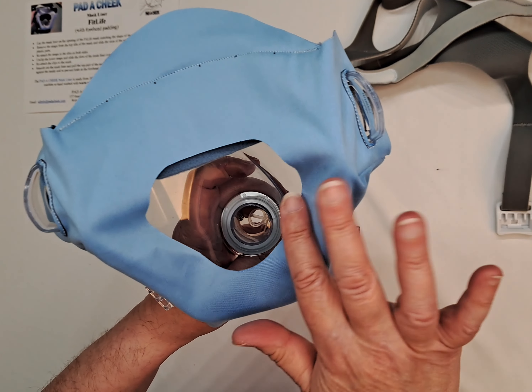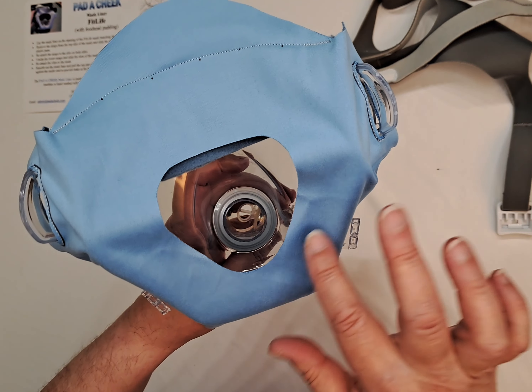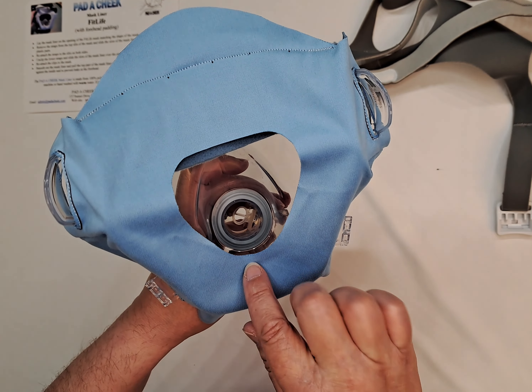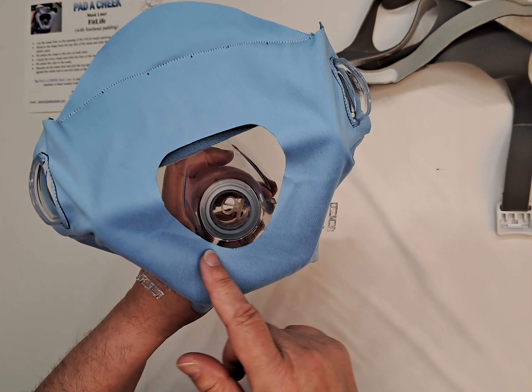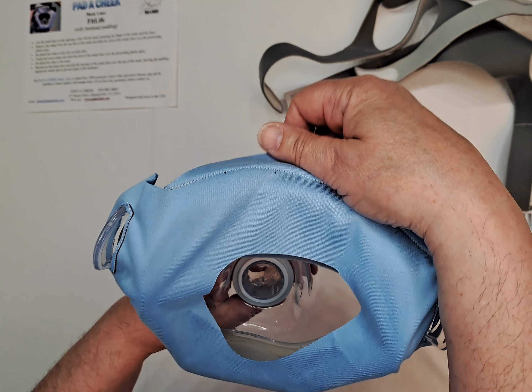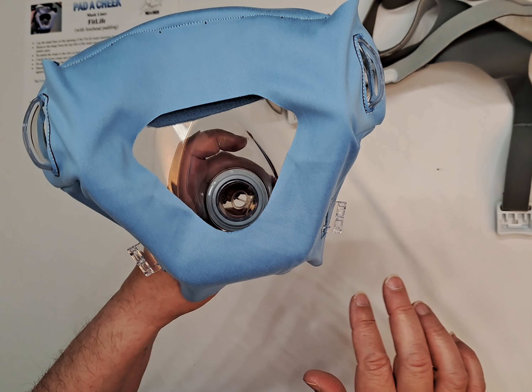If you need to make the hole larger, that's easy to do. Just take a pair of sharp scissors and cut very close to the line. Don't cut too much at one time — try it, and if you need to cut some more, cut some more.